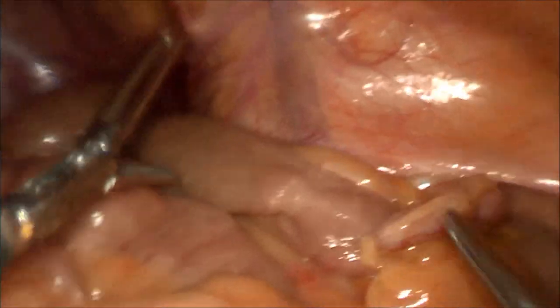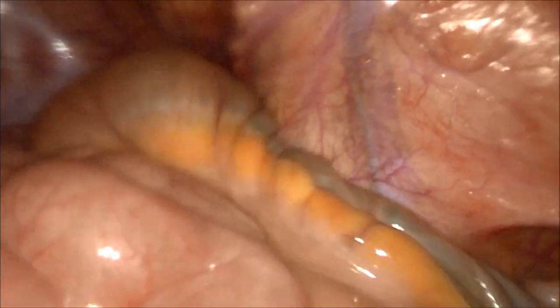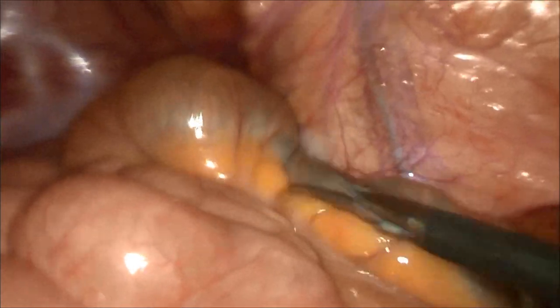An initial diagnostic laparoscopy is done looking at the liver, the small bowel and the colon.